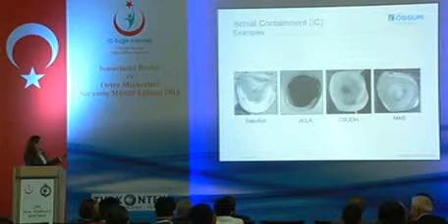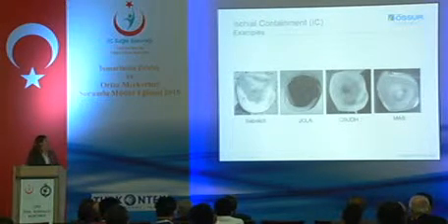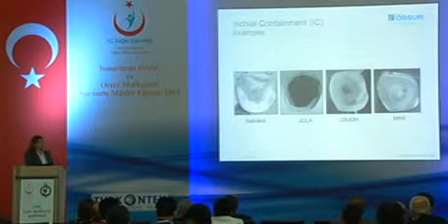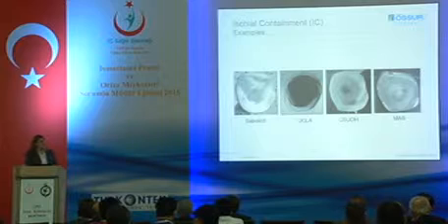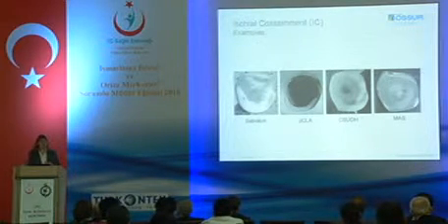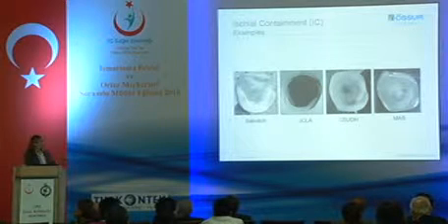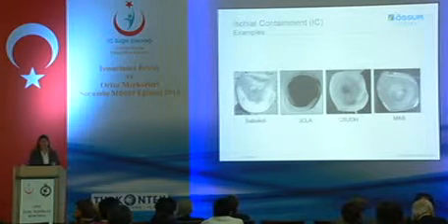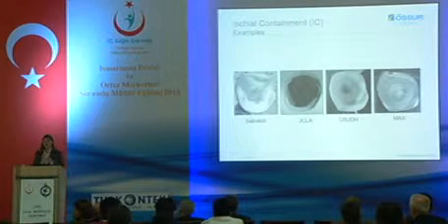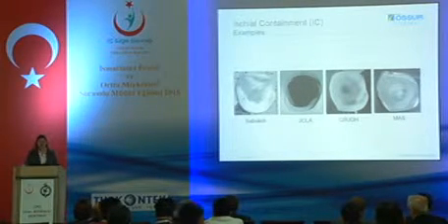So we have the Sabolich, who was pretty much the first person to describe the shape, and then the variations upon that. We then, I think, around the start of the 2000s, Marlo Ortiz came out with a MAS type socket design, which changes it from ischial containment to ramal containment.